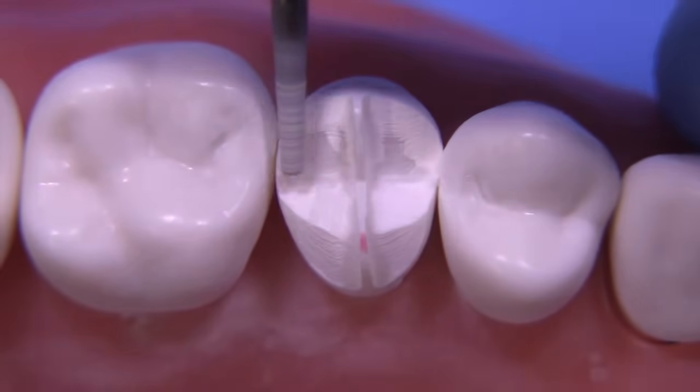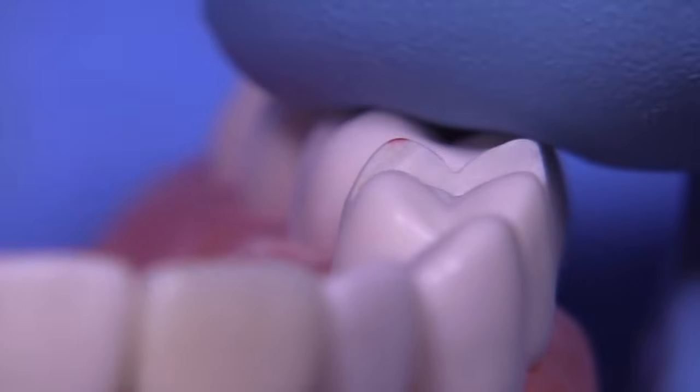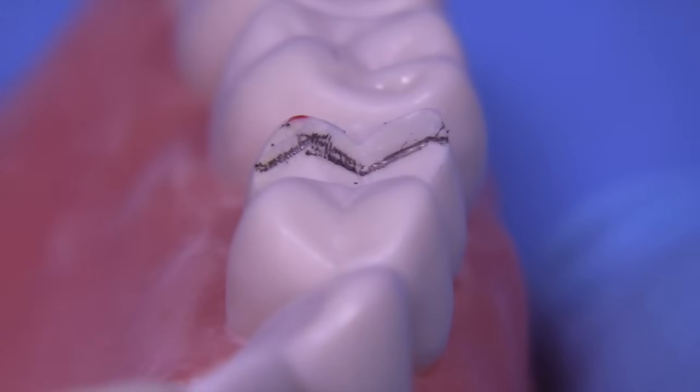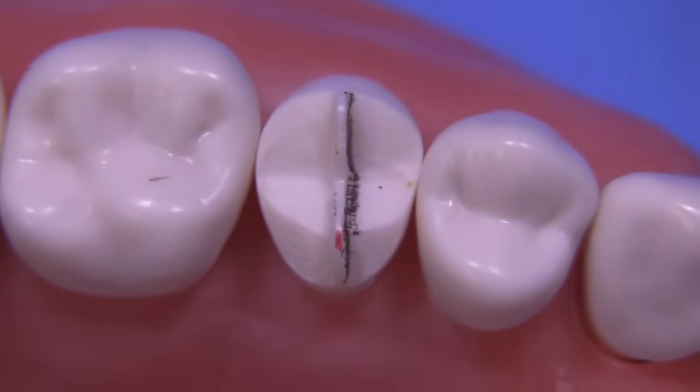We're still using the same bur, the 847 KR 016. I just use a pencil here to highlight the intersection between the tenon and the prepared surface so you can clearly see how much you've taken away.